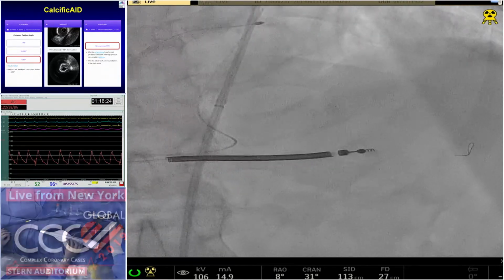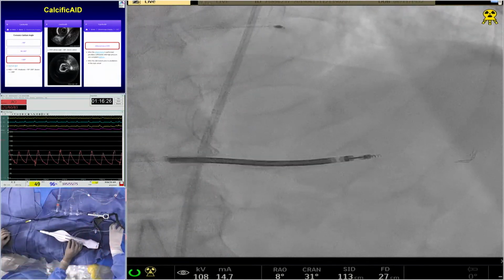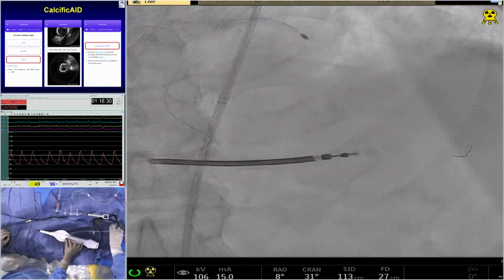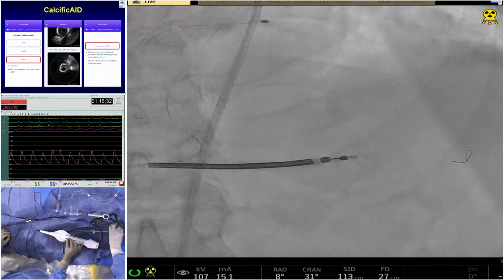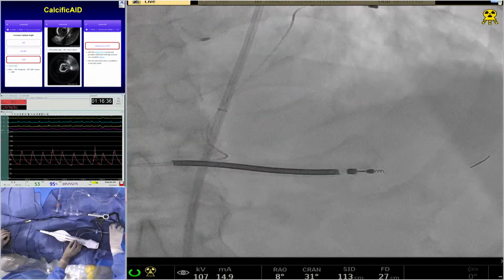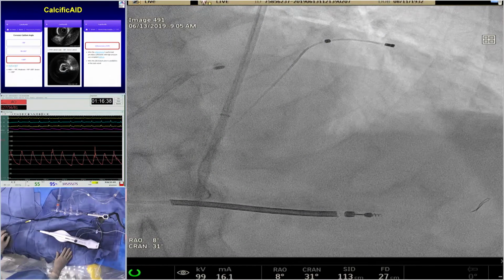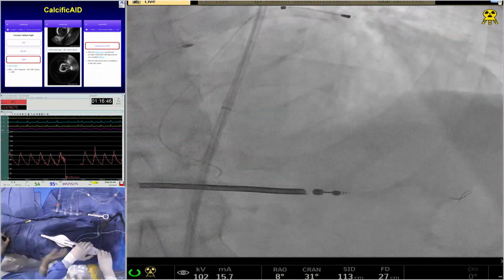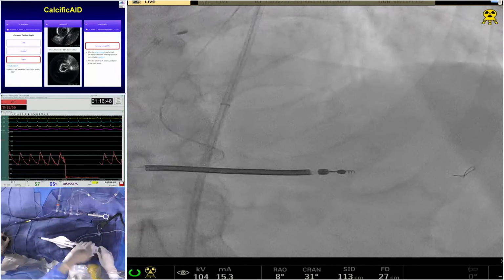But you see she's already gone through. Blood pressure looks good. So far, so good, Dr. Kinney. You made your turn around. You're using the floppy, and it looks like you've already gone through the entire lesion. And you see she's going back and forth, slow. I think the lesion will come out now. Okay, yeah. And the moment of truth will speak for the slow flow now.